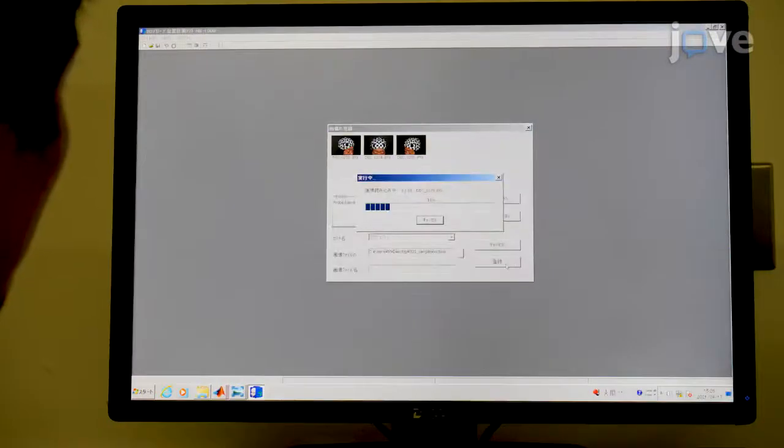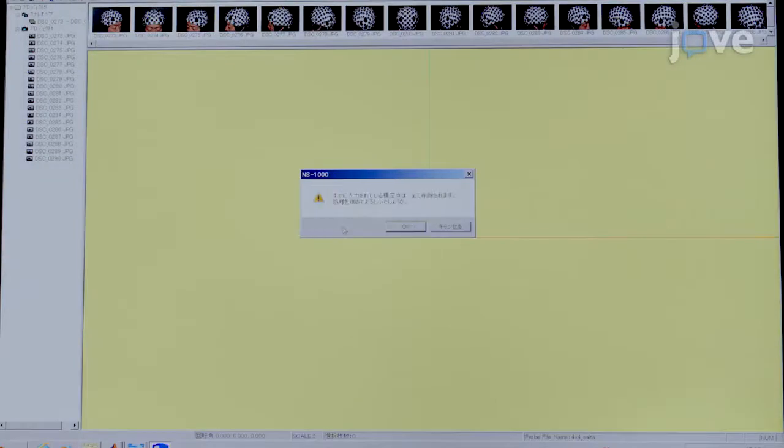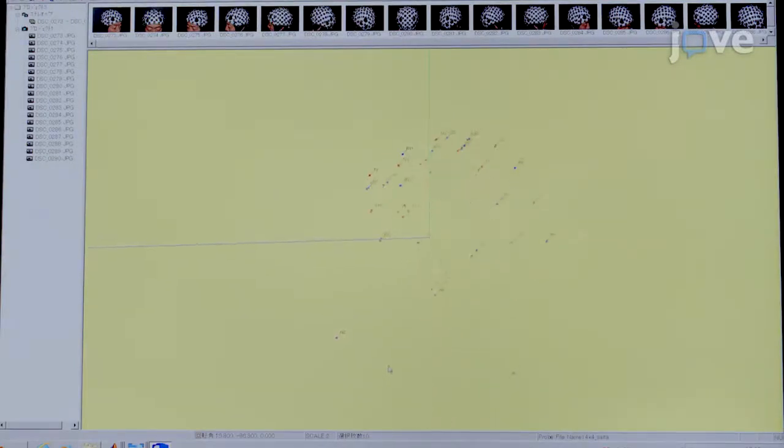Arrange the 48-channel system with 32 optodes to a head cap bilaterally over the frontal and parietal areas as regions of interest, and use the 3D digitizer software to determine the spatial registration.